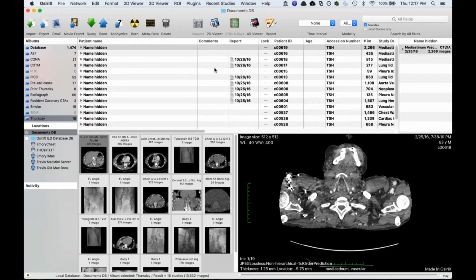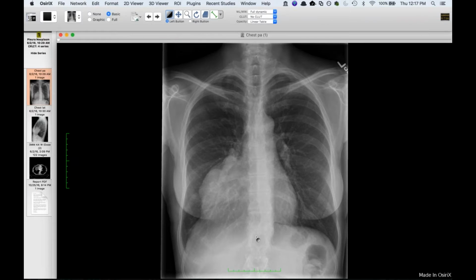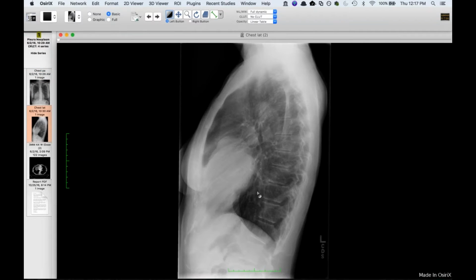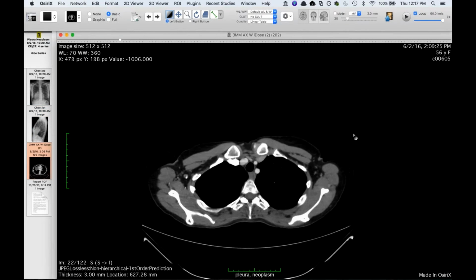All right, let's see. I'm glad David's on here because I'm going to show this. I remember David showed that funky, what looked like a mediastinal mass that I think turned out to be a fibrous tumor. Wasn't that you that showed one a couple of months ago? Yep, I remember that. Well, here's another funky mass, and you can see you've got a hilum overlay sign. On the lateral view, it sure looks like it could be in the anterior mediastinum or along the mediastinal pleural surface. And this is a 56-year-old woman.